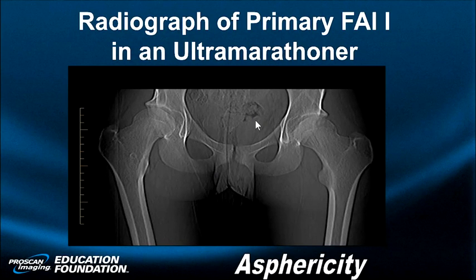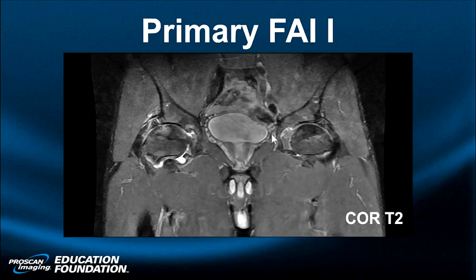Now you know, you've been around a long time, when the first person that's ever interviewed you for a job after your fellowship calls you up and says, "Can you look at my son's MRI?" So I was honored by that, of course, but I was also humbled by it because it meant I'd been on the earth a while. Her son was an ultramarathoner, one of these guys that ran 80 or 100 miles. Look at his plain film, undercovered bilaterally.